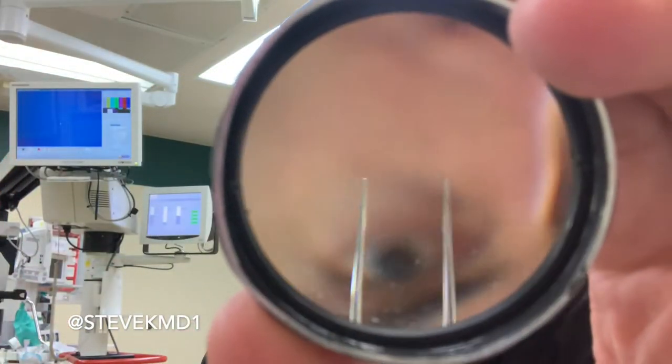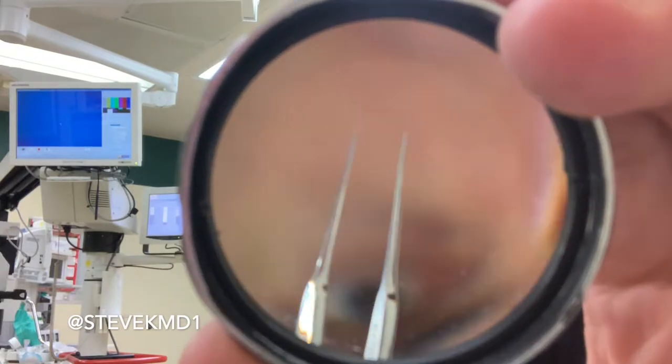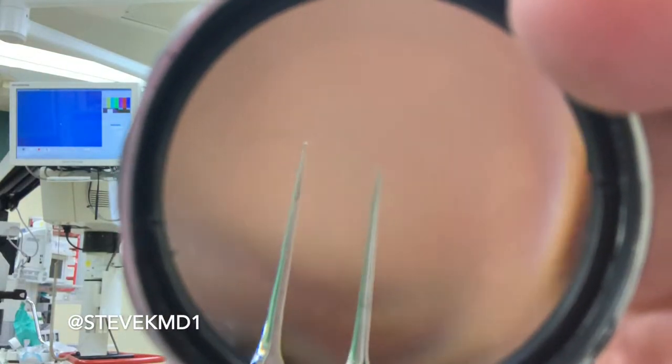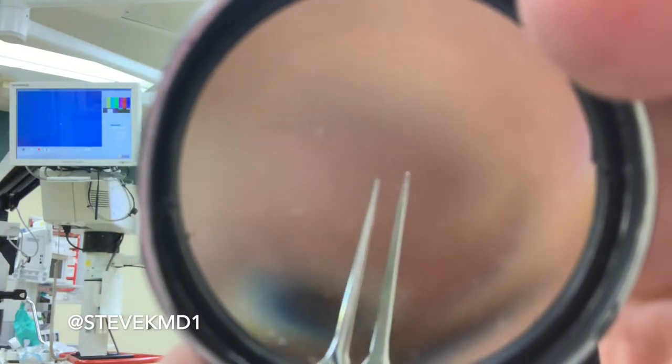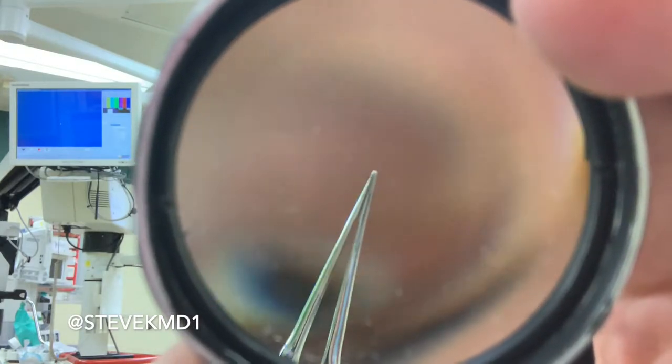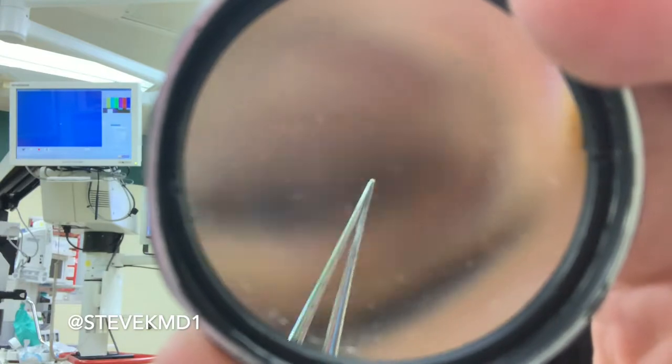Some other things we might use are 0.12 forceps — those are really common. The 0.12 size has to do with how big the teeth are on the end. They are so small that it's hard to even see the teeth, but they are there, and they grasp the eye and hold it in position.